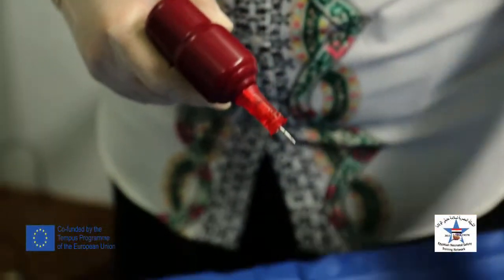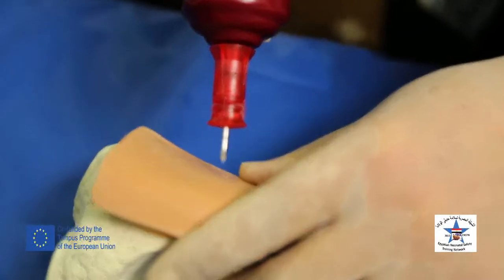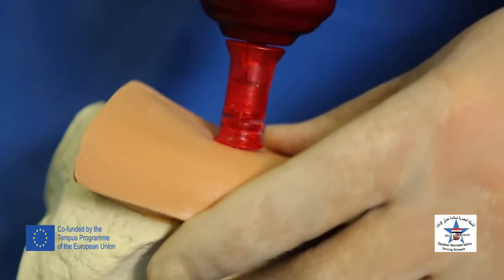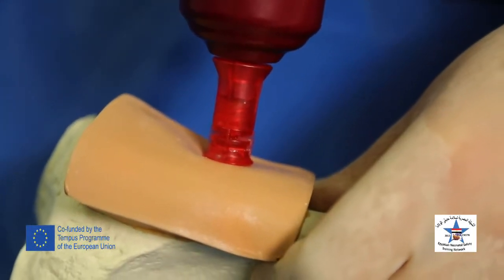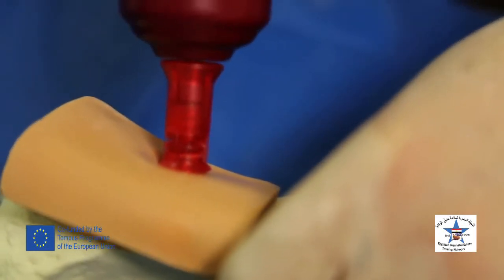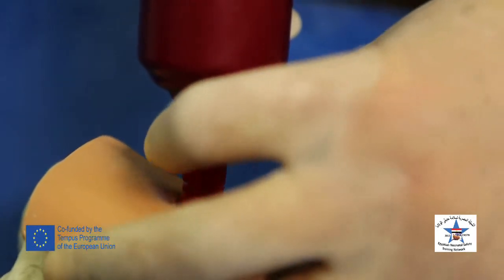Removing the cap of the needle, we will approach the site of insertion in a perpendicular direction to the bone, piercing the skin and the subcutaneous tissue until resistance is felt due to the bony periosteum, and then press the button on the drill and the needle is inserted.